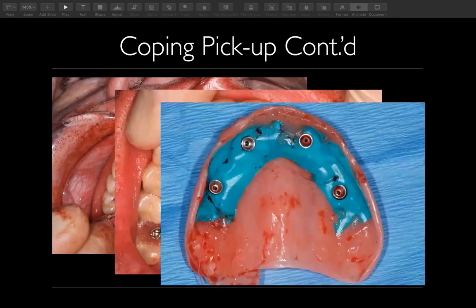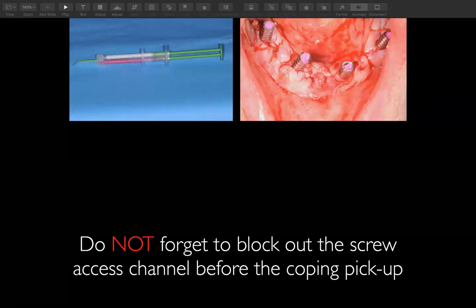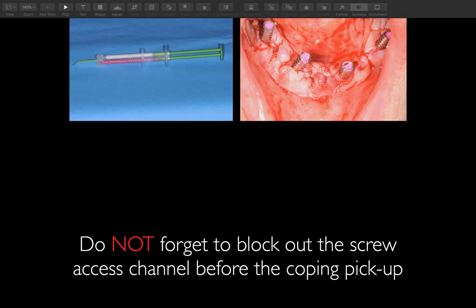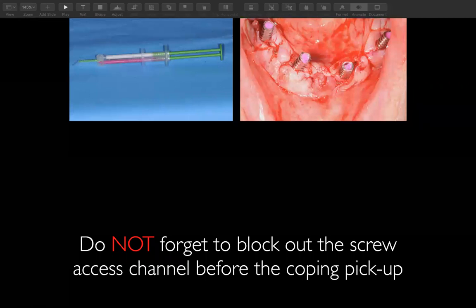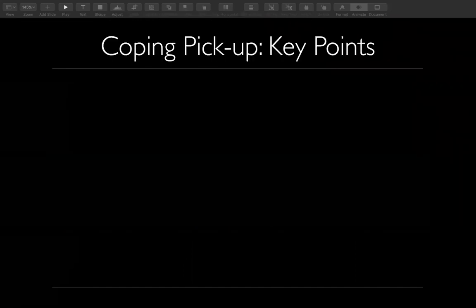Again, here, the upper being picked up, same thing with the rubber dam. Years ago, we used to use cotton pellets to block this out. After sometimes spending 30 minutes trying to retrieve a cotton pellet out of a cylinder because it got pushed down too far, that would be the last time you'll do that. But Teflon tape can work. Some doctors like using impression material. They just put an Explorer in there and pull it right out. It comes out nice and clean. Then the healing caps go back on while we're doing the conversion.